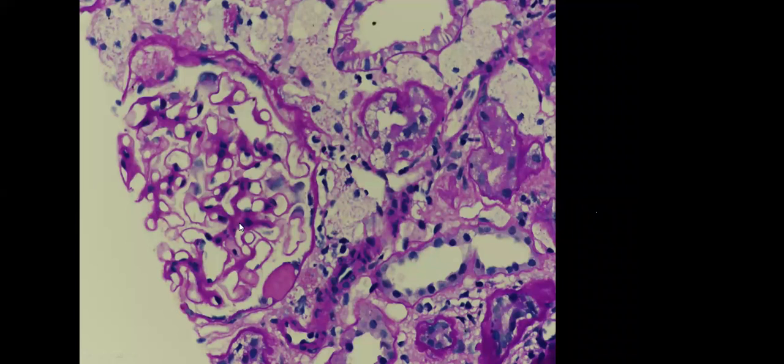So morphologically, it could be diabetic, because there is some mesangial expansion also, but no mesangial hypercellularity, and no nodular glomerulosclerosis lesion. So practically early diabetes.